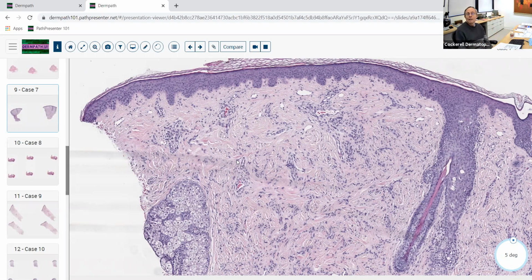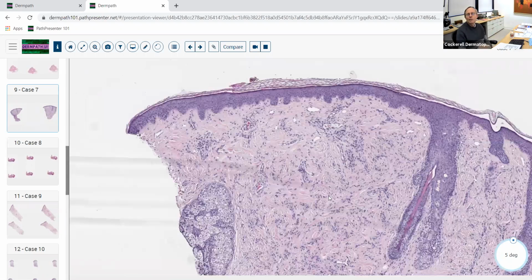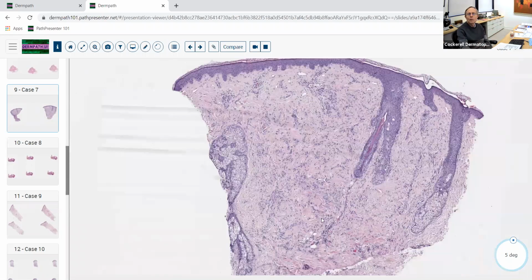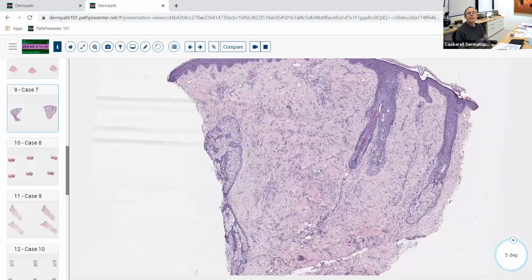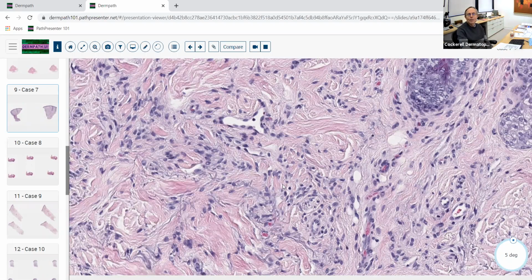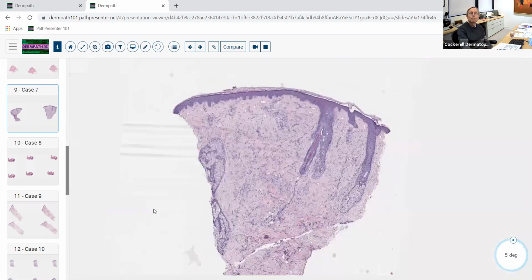It can look almost like a cutaneous myxoma in some of these cases, but probably the ones that are papular mucinosis usually have more of these fibroblastic cells diffusely in the dermis. They demonstrate this characteristic splayed pattern that we see here. So that's scleromyxedema. And the myxedema part comes from the cases where they actually get the mucin.